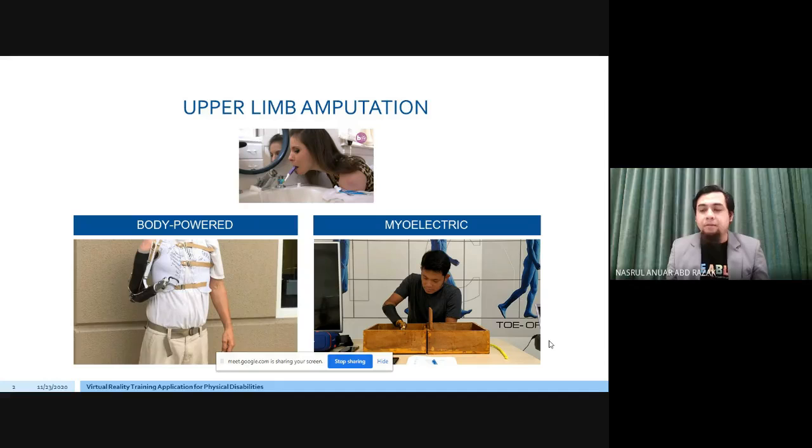Okay, so you might feel like you are wearing a shoe that is quite tight or quite loose, but it's actually in a fixed size. Same to the prosthetic user as well. What I'm trying to say is that the position of the EMG might be interrupted as well, so the sensitivity of the EMG is not that accurate. This might cause a delay to the prosthetic user. They might need time to adjust accordingly to what is being provided to them.